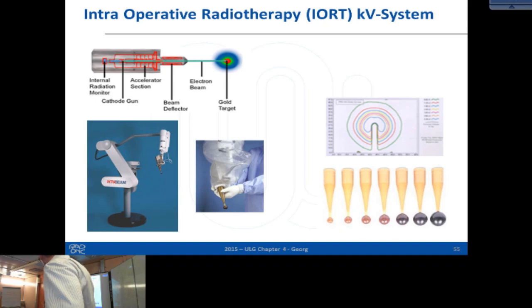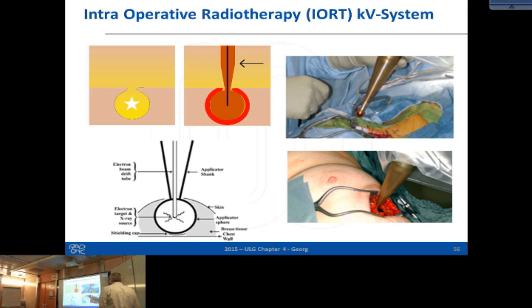The company producing the Intrabeam device is called Zeiss. So from Zeiss you can buy this, and this is showing the principle of its application, where you need this special intraoperative applicator when you put this into the operation wound to get a fixed distance around the target. Because if you wouldn't have such an applicator, you would have different distances from the tissue that you want to treat, which is the surgical bed, indicated here in red. By having a fixed geometry, you can homogeneously irradiate these small layers of tissue. If you wouldn't have such an applicator, you would probably get a wild mixture of different distances, and there you would have a vast variation in the dose distribution.